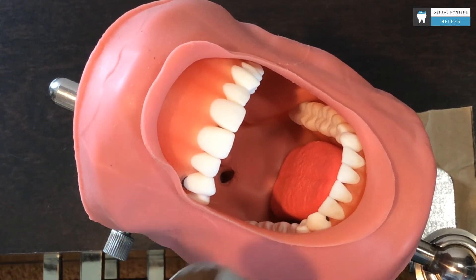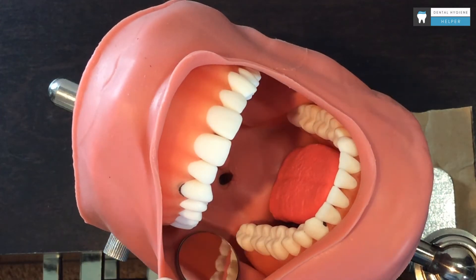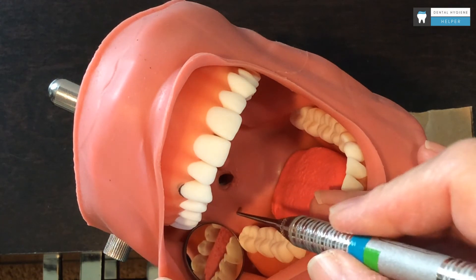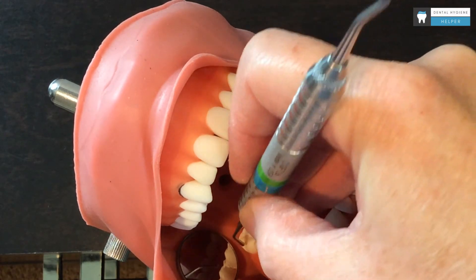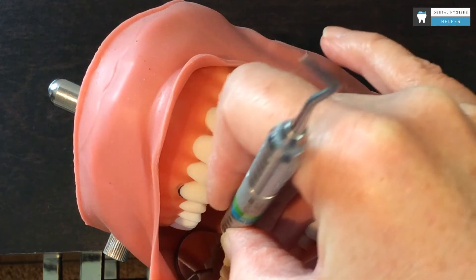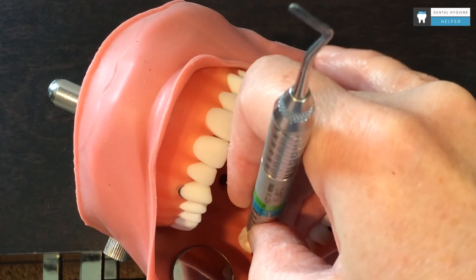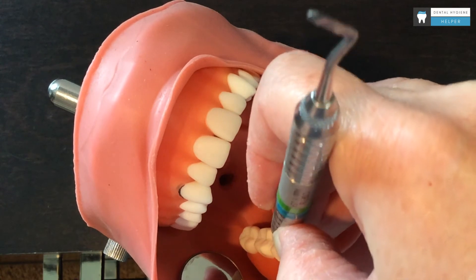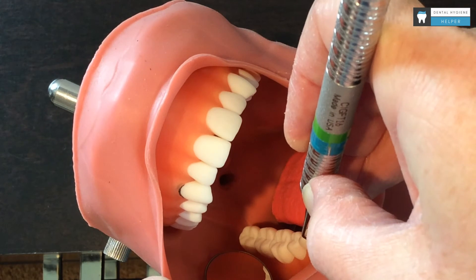Now let's do the mandibular posteriors. I am going to retract just like we did on the top with my mirror, and it gives me some vision as well as some illumination. I can then go back on my instrument just a little bit and fulcrum on the lingual cusp tips — I am not fulcruming on the lingual, I am on the lingual cusp tips — and then onto the incisal edges of the anteriors as I move forward.